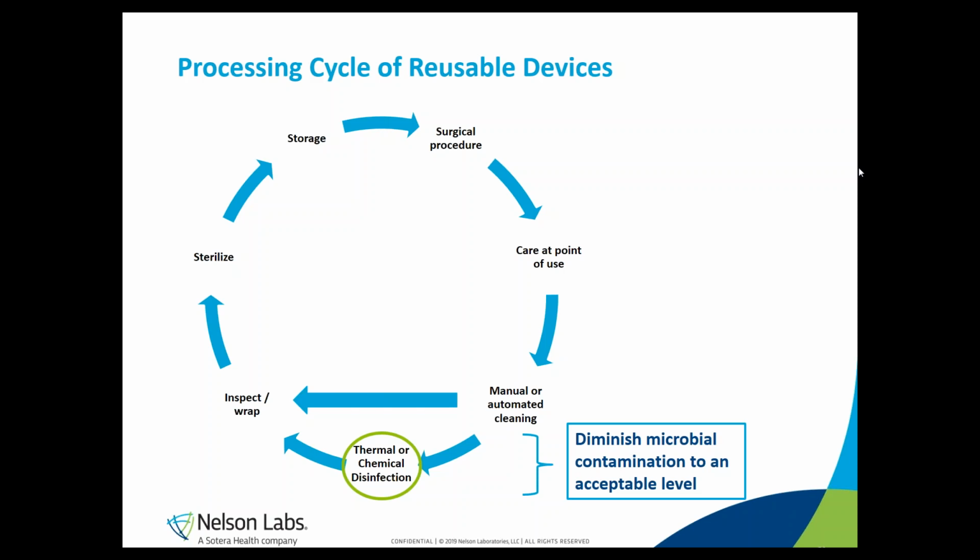So, a cleaning validation actually assesses the efficacy of a process designed to affect the physical removal of contamination from all surfaces. During a disinfection procedure, the microbial contamination on the device is diminished by killing microorganisms to an acceptable level and using an appropriate disinfectant.